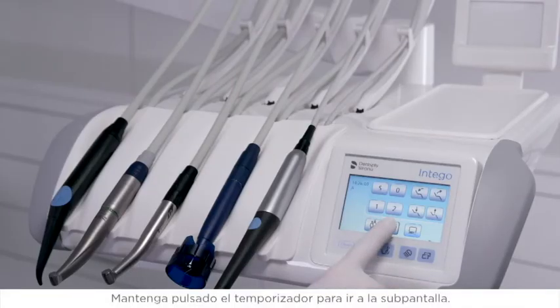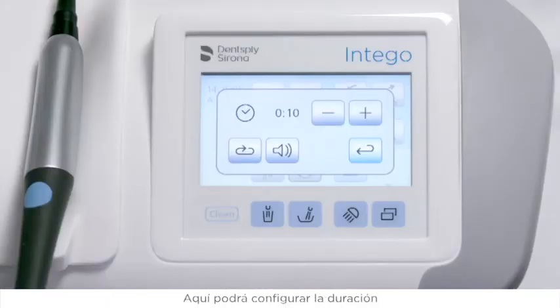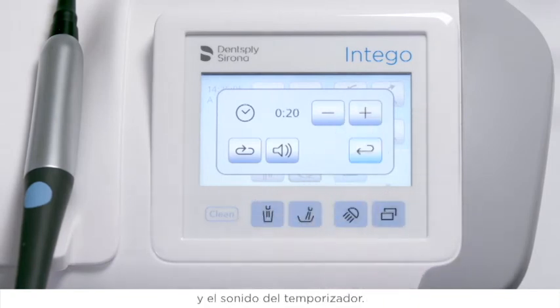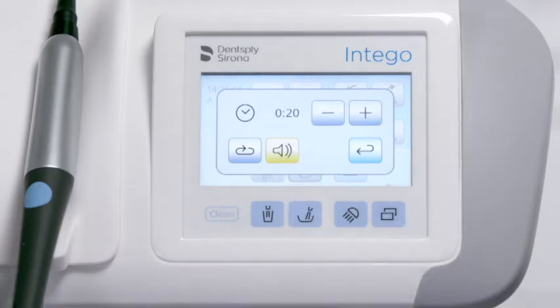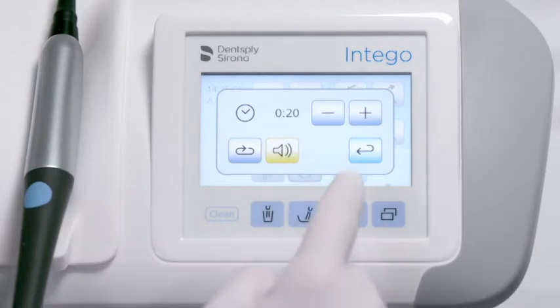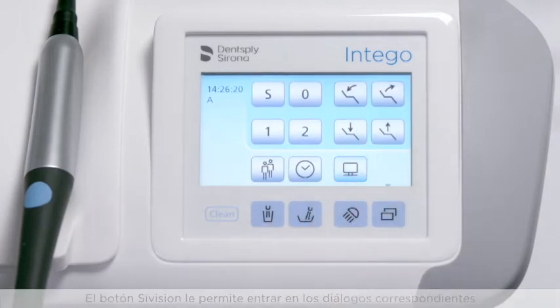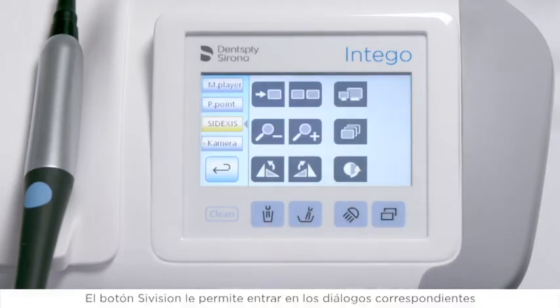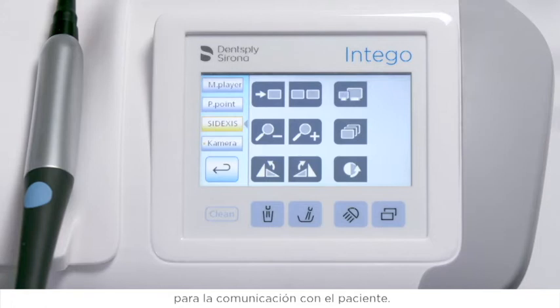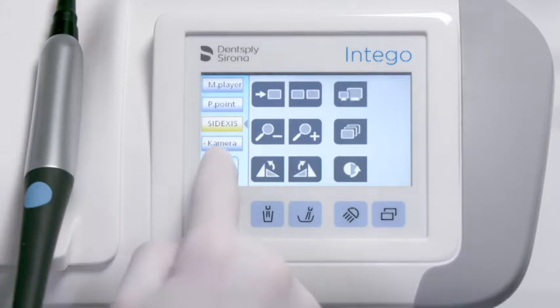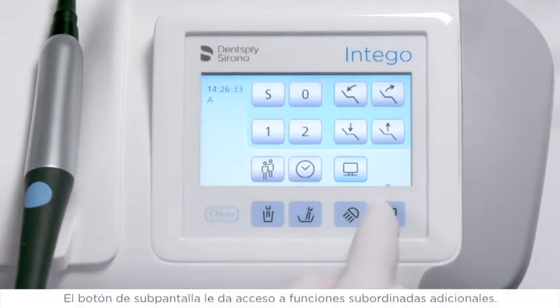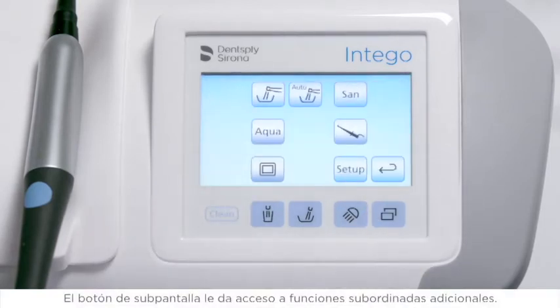Press and hold the timer to go to the sub-screen, where you can set the duration and the sound of the timer. The sub-vision button allows you to enter sub-vision dialogs for patient communication. The sub-screen button gives you access to additional subordinate functions.